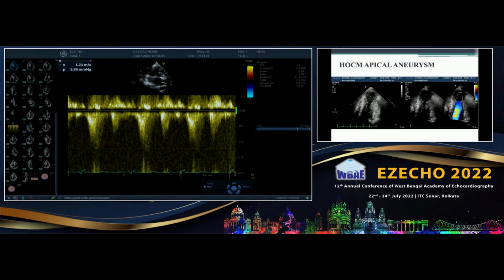And then the crypts. Yeah. May I make just a point? You are all talking about the mitral valve pathology in HCM. Recently, I came across a case report. There, not the AML, but the PML was the cause of subvalvular obstruction. Correct. Yeah, there's a case reported there. So we have to look for unusual things. Absolutely. There may be chordal pathology as well. Right. So in HCM, yeah, I think that's a very valid point.